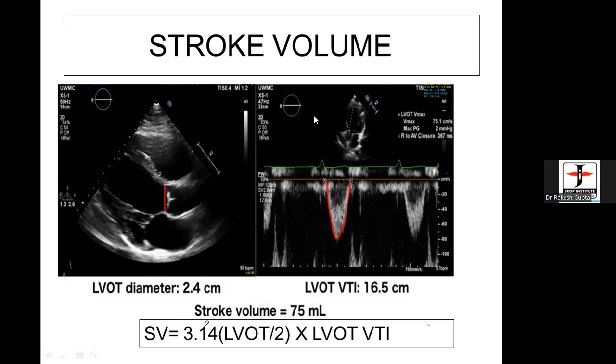We conducted a program for GE where every measurement, LA, LV, is available on these machines. In fact, I still remember about 5 or 7 years ago, Siemens was the first one to show artificial intelligence, in one of the conferences, when they demonstrated the Siemens machines. They are very good.